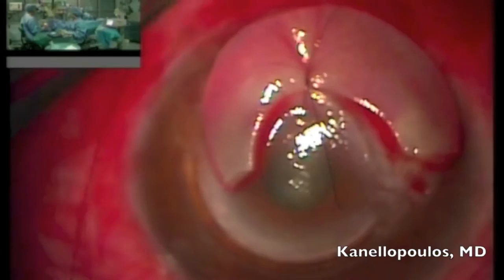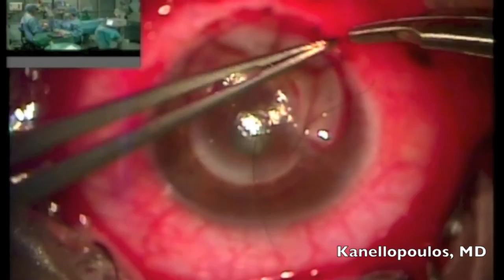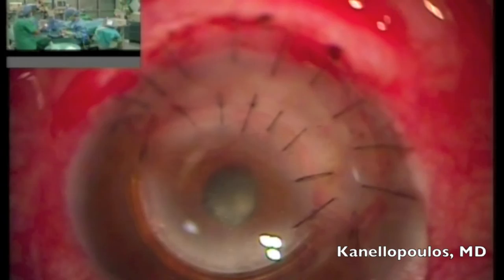This is the toughest suture, probably because it's very near the visual axis of the patient. The eye is blocked with peribulbar anesthesia. We're going along suturing this patch graft in place, and you can really appreciate the fact that it starts to fit in place regardless of the fact that it was quite larger than the defect — it's starting to take form and complete the corneal defect.